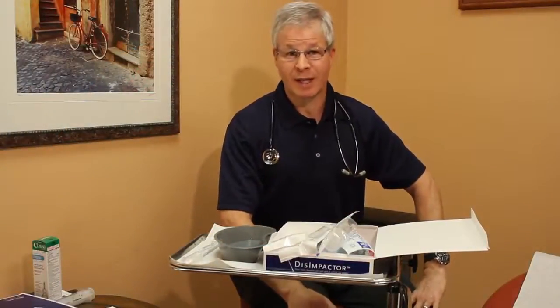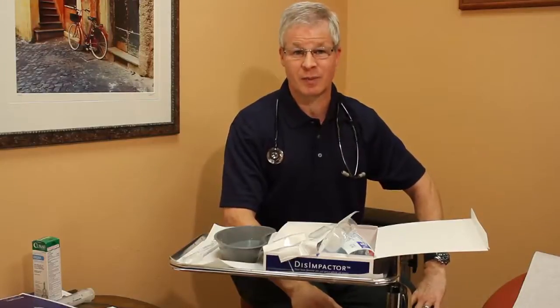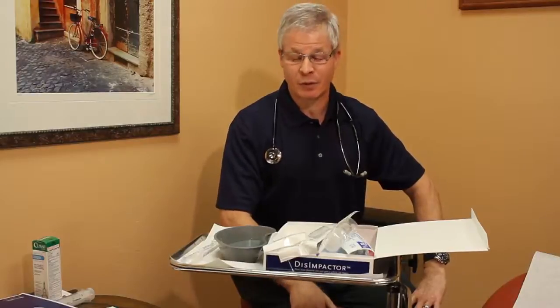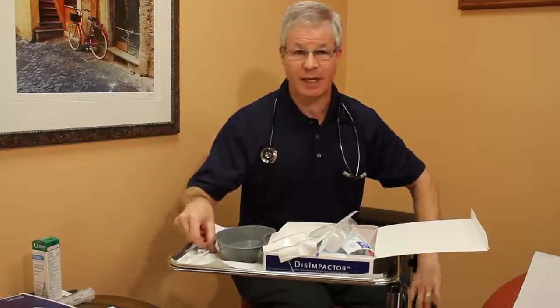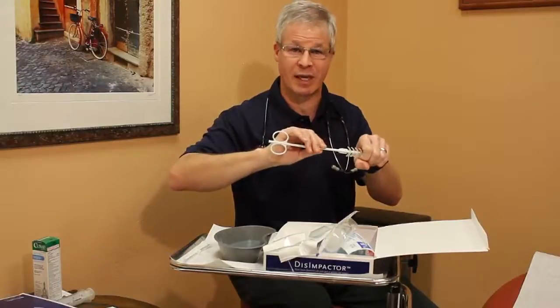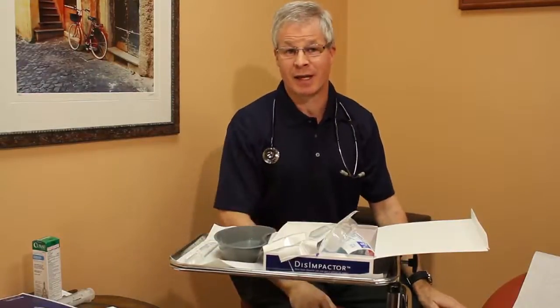So essentially, what we would do at this point is begin with patient positioning. If you're right-handed, what will be easiest for you is to have the patient in a left lateral decubitus position, meaning that the patient's laying on their left side and then preferably with their right thigh drawn a bit up toward their abdomen. That will give you the best access for manipulating the device if the patient is here and the device is coming in this way, utilizing your right hand. We'll also want to make sure that there's a chucks pad under the patient to catch any spillage.